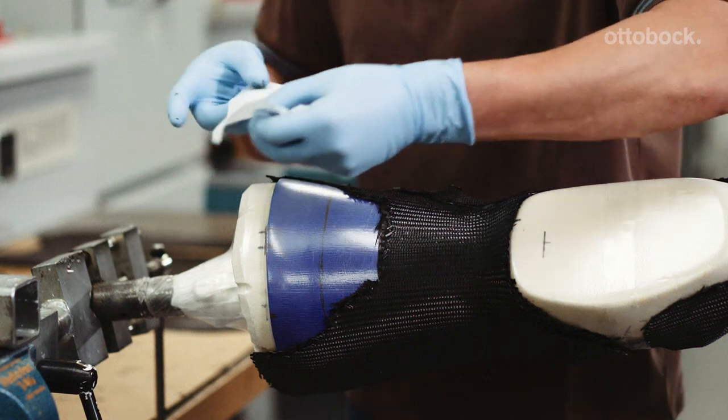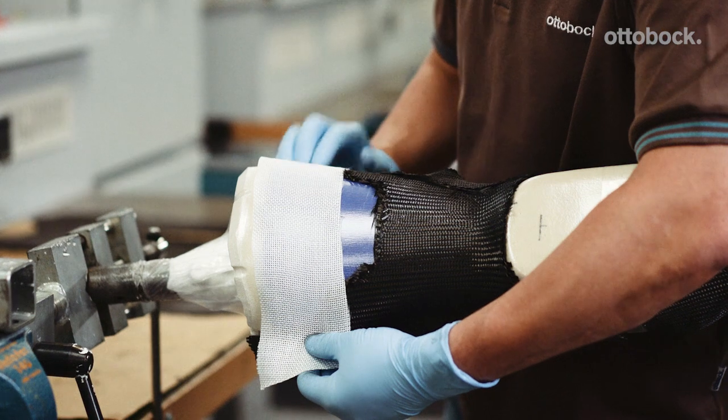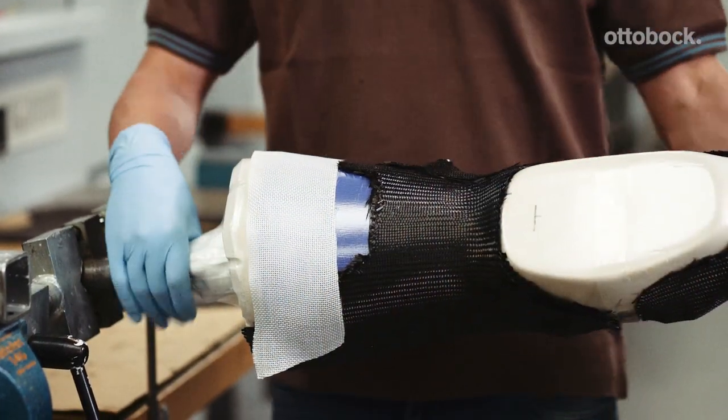Cover the posterior soft surface with one layer of Orthopox cloth flex. Make sure no carbon fabric protrudes into the flexible posterior soft surface area.